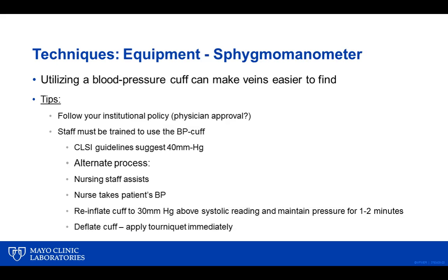Take a look at some equipment. The first one we'll look at is the sphygmomanometer. You have to put that word up there. It's more fun to say than a blood pressure cuff, but that's what we're talking about. For some people, it's easier to say. The use of a blood pressure cuff is something that's fairly common. I wouldn't say that it's used on a daily basis, but it's one of those techniques that we can use, and I would say it would be something that wouldn't be a first choice.